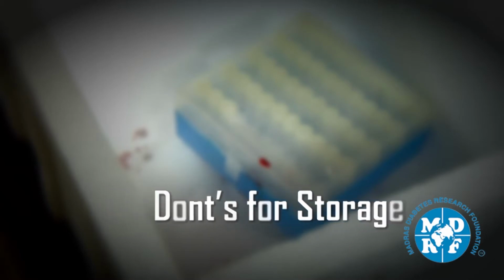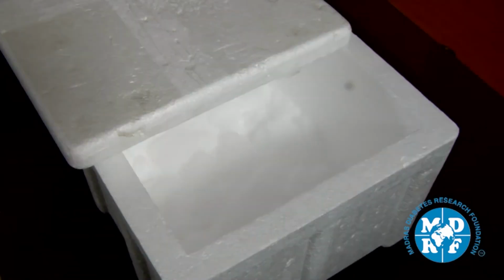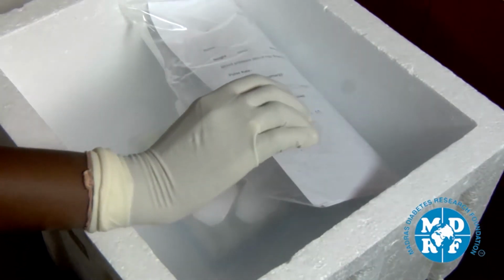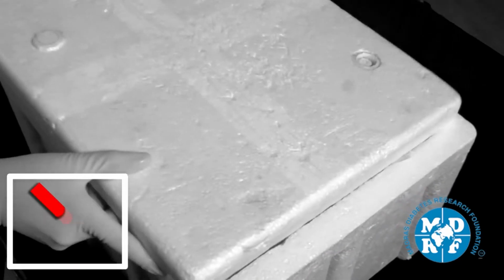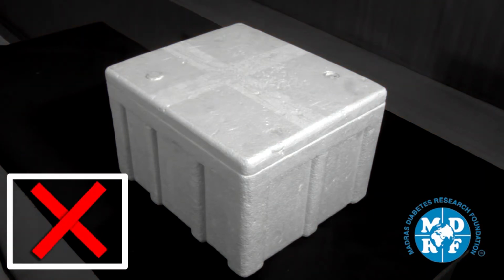Don'ts for storage. Do not spill the samples. Do not keep the ice box open at any time. Do not keep anything else other than the blood samples in the ice box. Do not leave the ice box unattended in the field.